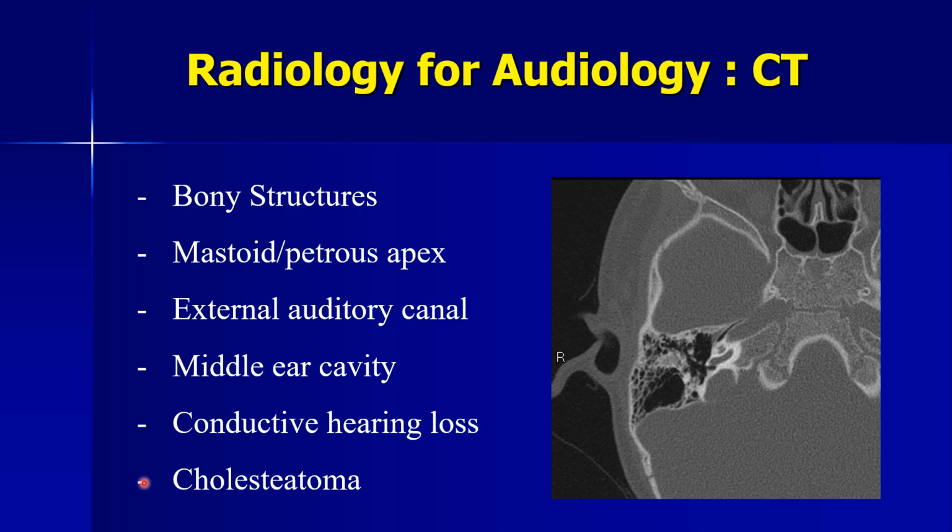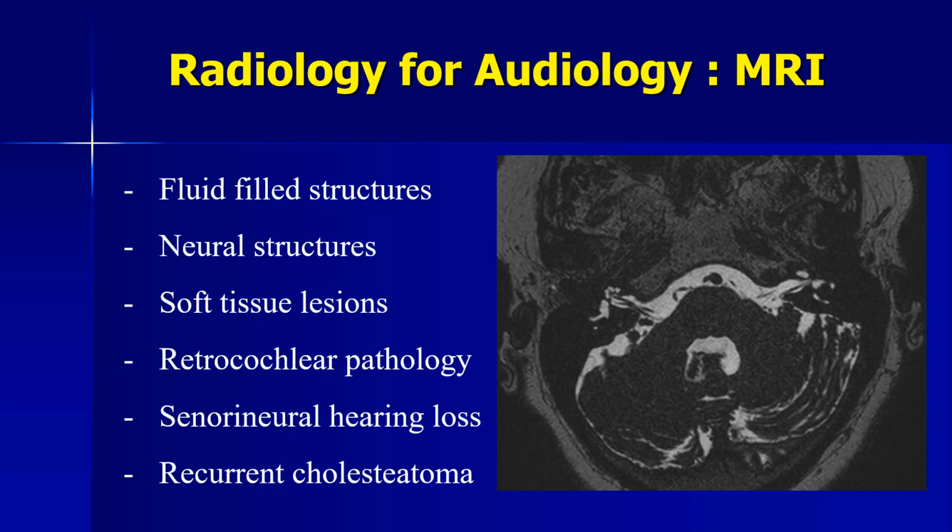In that particular setting, MRI can be very helpful and more sensitive by demonstrating restricted diffusion to make the diagnosis of cholesteatoma. So both CT and MRI are complementary.